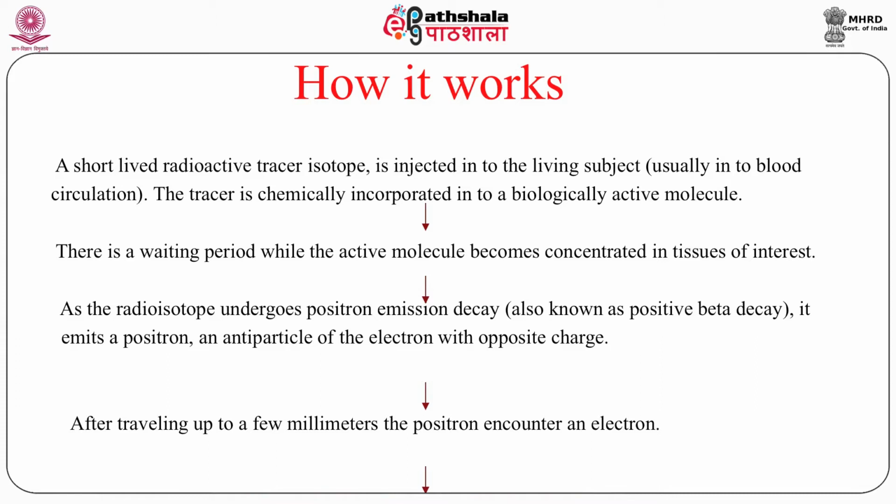The tracer is chemically incorporated in the biologically active molecule. Now, there is a waiting period while the active molecule becomes concentrated in the tissues of interest. What does it mean, waiting period? Usually, if you go to a doctor and ask for a PET scan to be done, or you might have seen the hospital where the PET scan is being done, fluorodeoxyglucose labeled with F18 is administered to the patient.